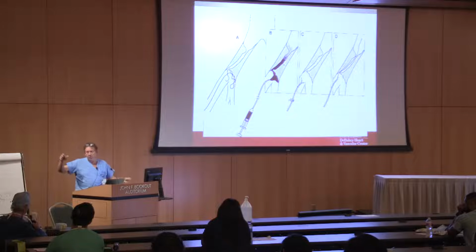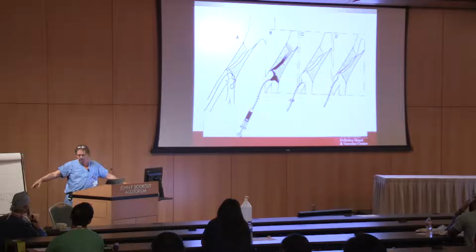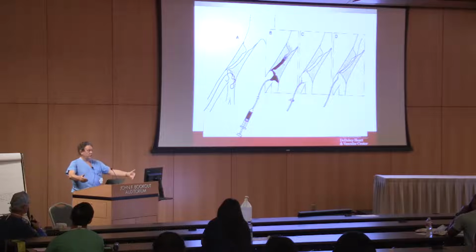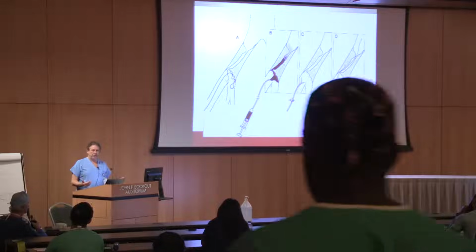Well, the reason you see all these hangers for hanging lead on is, don't throw your lead on the seat here. Somebody comes in and sits in the seat, the lead gets fractured, and you can't see it. So their job is supposed to be to come around and take all the radiation protection suits and x-ray them to see if there are any fractures inside. So take care of your lead. Don't let anybody sit on it, hang it up, and don't just throw it in a corner. And you see that almost ubiquitously when you're walking around these rooms.